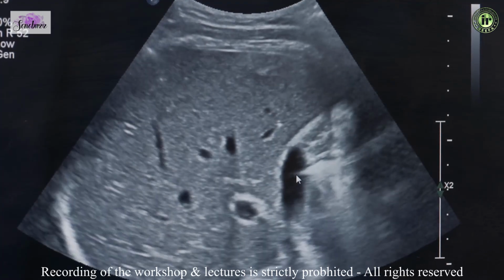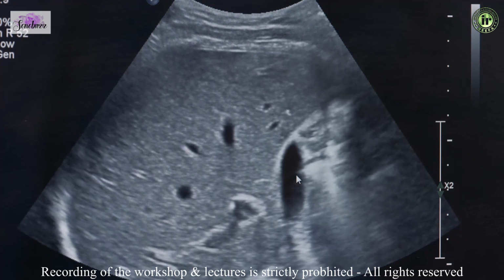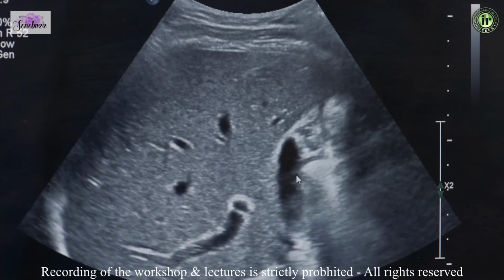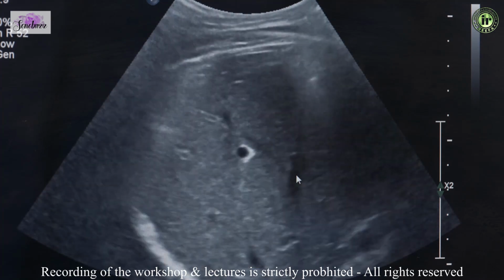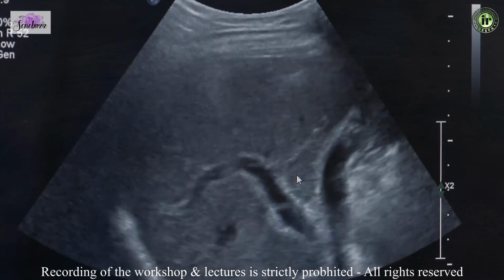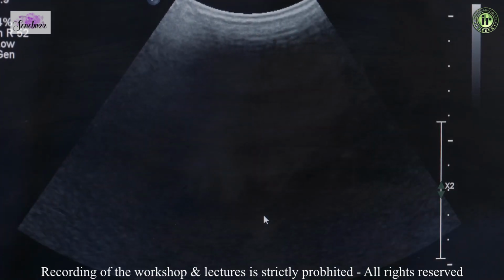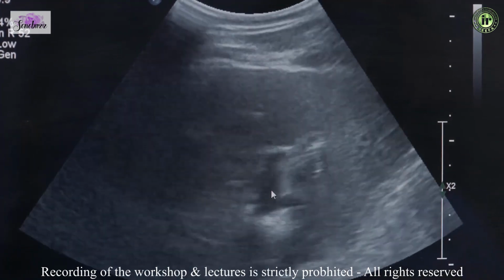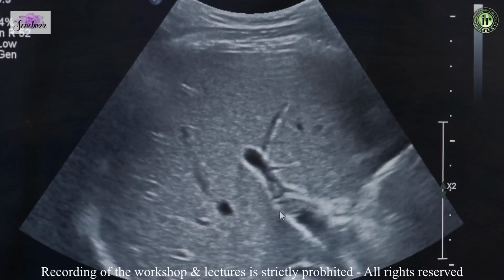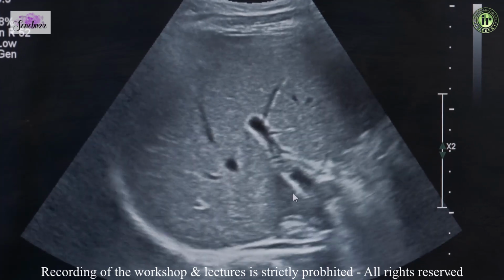Starting with our elastography study, now that we have fulfilled all our baseline criteria, we know what we are looking at, we know what the background clinical history of the patient is, we can start with the scan. Now again, before we go on to taking the elastography findings, it's a very good idea that we just scan the patient, we get a general brief idea about what we are looking at. Is there any cirrhosis, if at all? Have a quick look at the portal vein. Go on to the other side, you can have a look at the spleen. You can always check for the presence of any collaterals if necessary, because if you have a frank portal hypertension, we should be able to pick it up very easily with just our B mode findings.